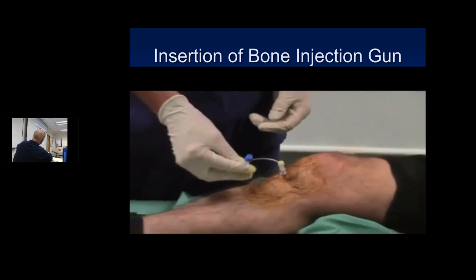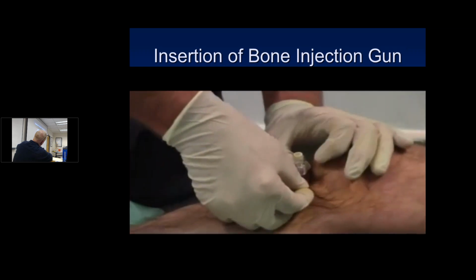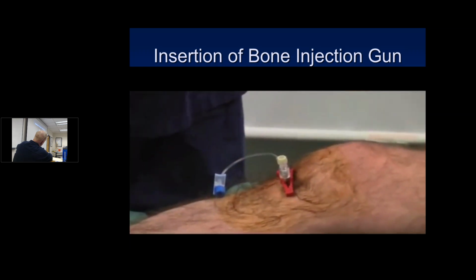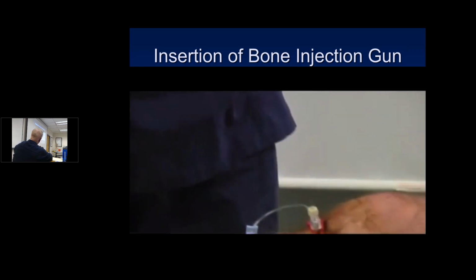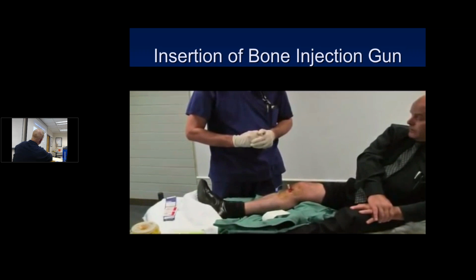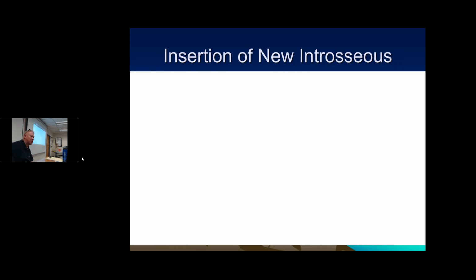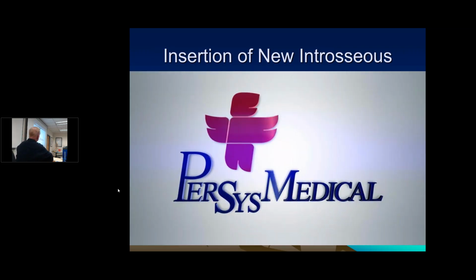By the way, these needles, the adult-sized needles, and the same thing for these right here, are about 15 gauge needles. So that's a different variety. And finally, this is the one that is fairly new on the market. It is kind of similar to the last one that you saw.